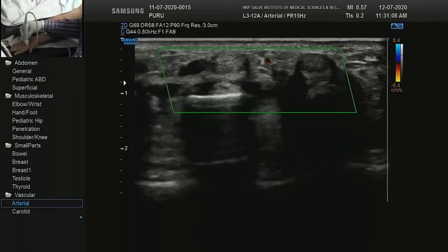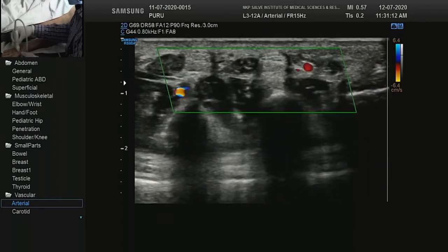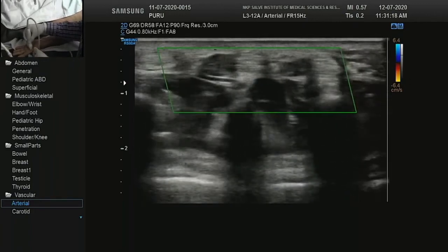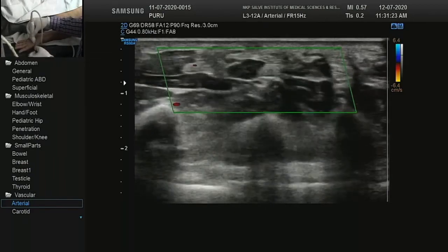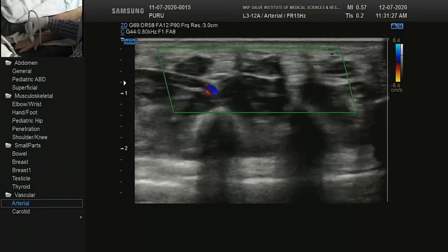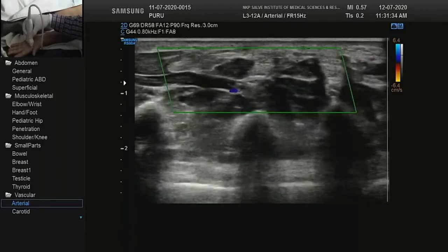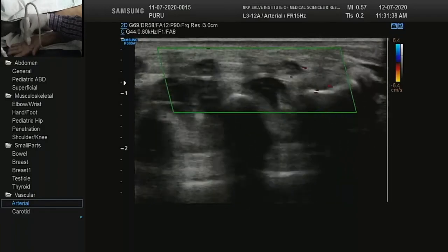So I am in the palm region. You can see multiple vessels. This is a transverse section. There are arches, and complete arch evaluation is many times not possible due to Doppler. What is of interest is the indirect evaluation of the patency that you have to do by various maneuvers, as we have seen.